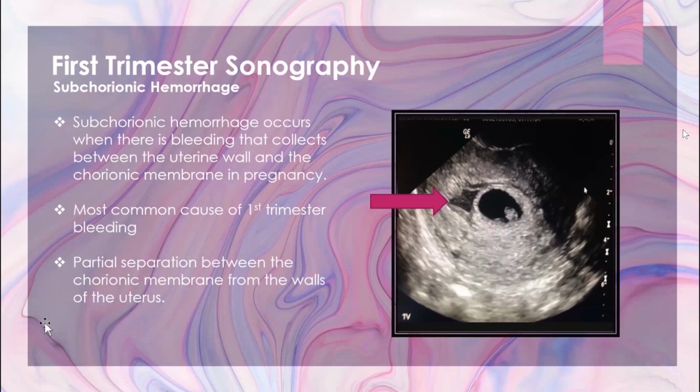You should be able to confirm fetal viability with your gestational sac, the appearance of it, the measurements of it, and if it's up to 8 weeks, the crown rump length. In your serial scans, you'll be able to tell that it is growing as it should, matching the gestational age, and then of course the fetal heart rate. And that will complete the first trimester sonography.